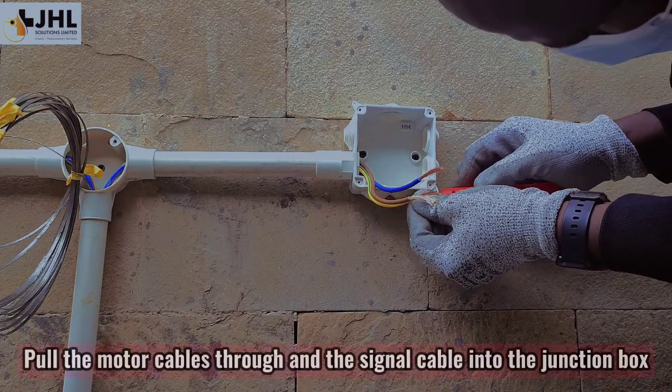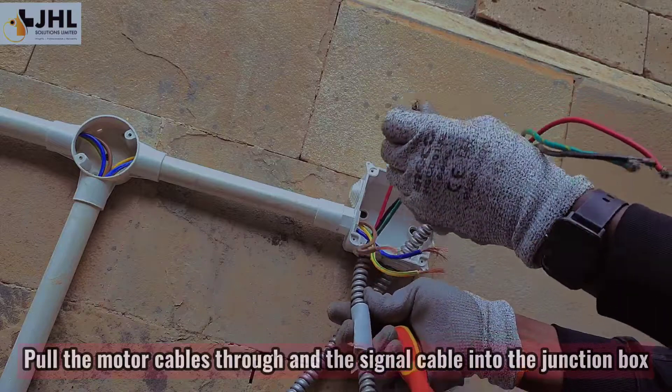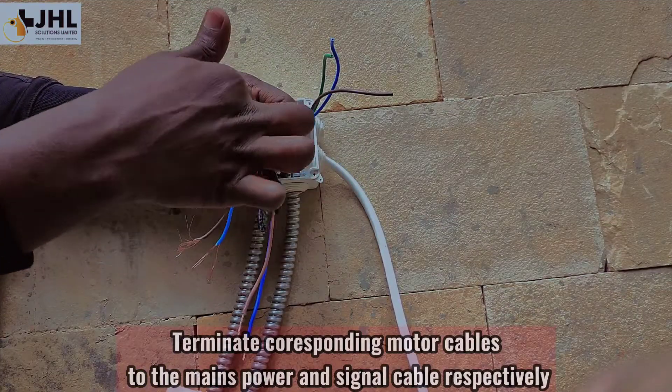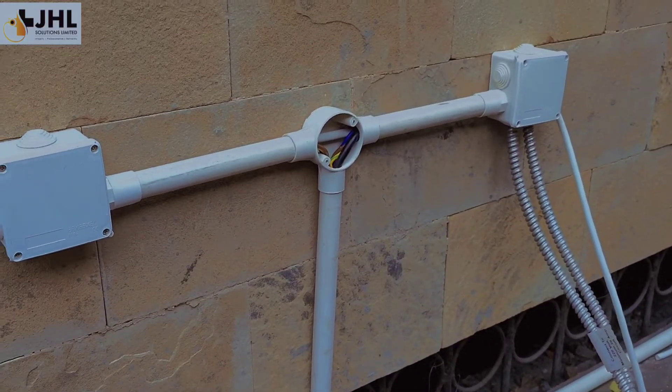Pull the motor cables through and the signal cable into the junction box. Terminate corresponding motor cables to the mains power and signal cable respectively. Electrical connection done.